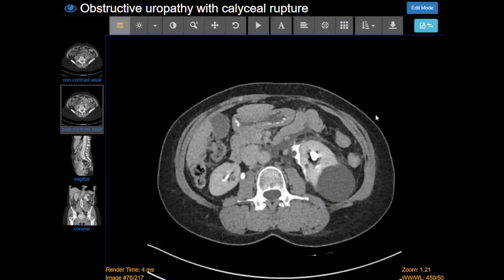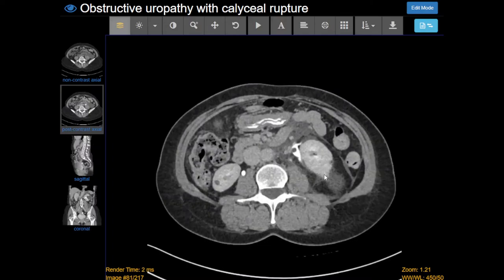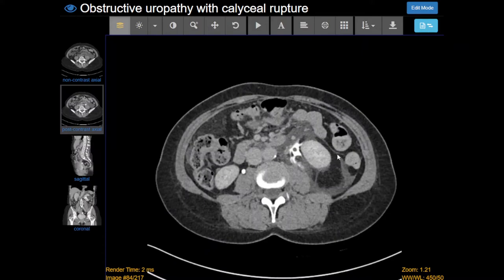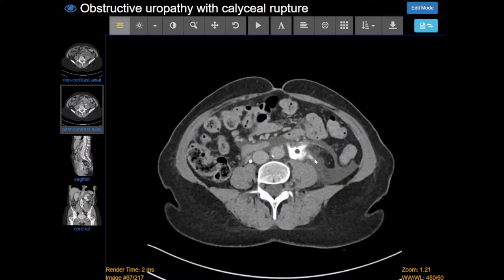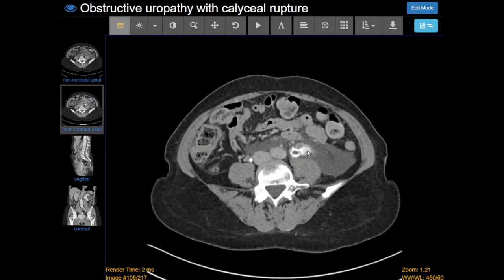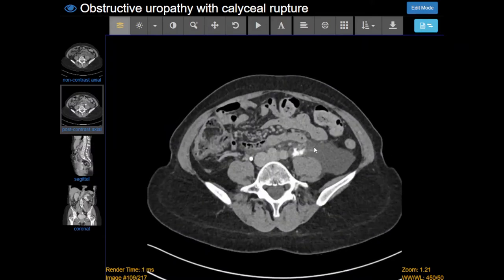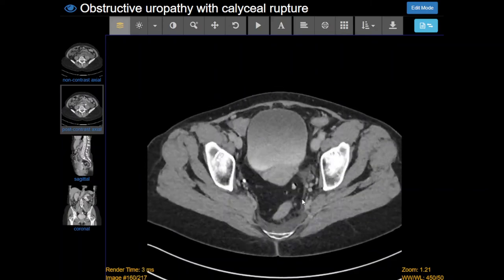So if we had imaged before the collecting system rupture, we might have just seen left hydronephrosis, maybe a delayed nephrogram because of the back pressure in the kidney. But since the collecting system ruptured, we don't see that hydronephrosis anymore — all we see is the urine spillage, and of course that stone, which is still there.